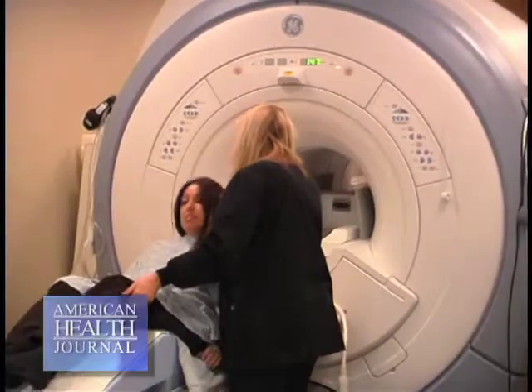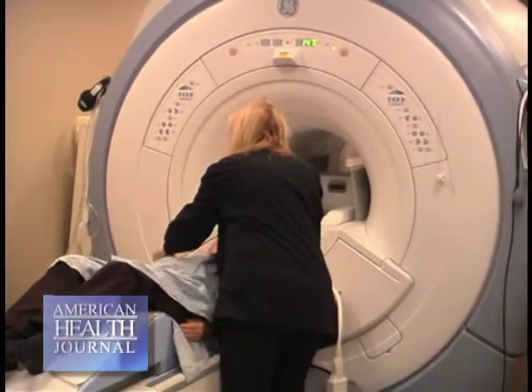And the saline implants are also safe. The saline implants are filled with salt water, and the advantage of saline implant is, of course, the fact that if it should leak, it's just salt water which is just absorbed by your body and you don't know the difference. And the other advantage is the fact that if it should leak or deflate, you know right away. Silicone implants are a little bit more difficult to detect if there is a leak because they are contained within the capsule and it sometimes requires an MRI to detect if it's leaking or not.